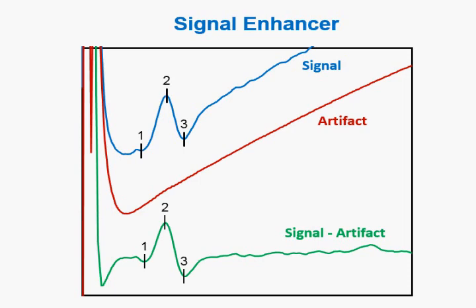Also note that the artifact removed by the algorithm does match its visual assessment. It does not show any significant portion of the sensory response. In other words, the signal enhancer has managed to preserve the sensory response and remove only the artifact. Hence, I feel confident in using digital enhancement when other methods such as biphasic stimulation or anode rotation are uncomfortable for the patient.